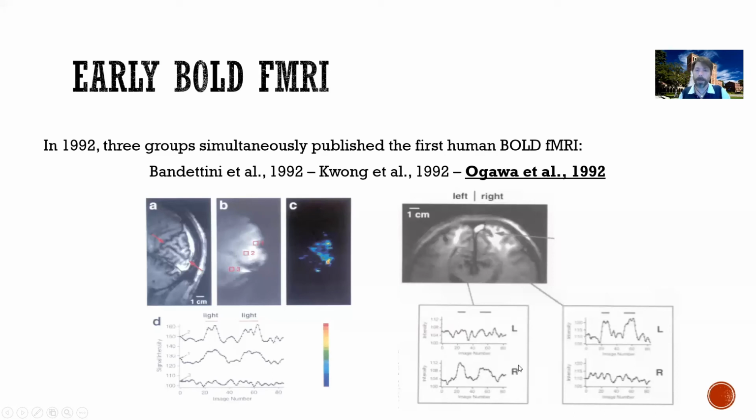So if you stimulate the right eye, remember, this is left cortex. If you stimulate the right eye, you see that the strength of the signal is at baseline during rest. Then suddenly the visual stimulation turns on, and boom, the signal increases a lot.